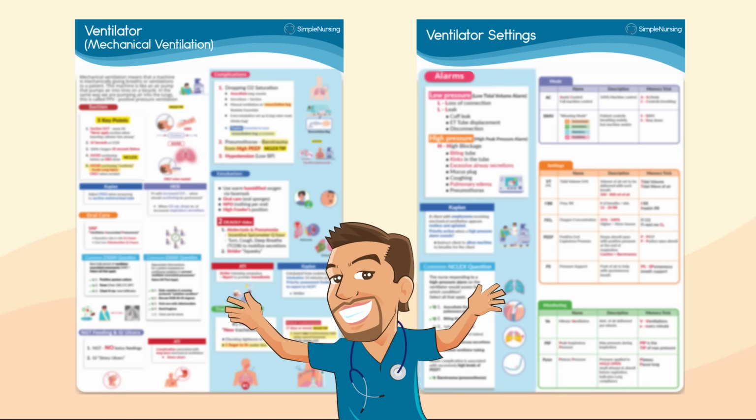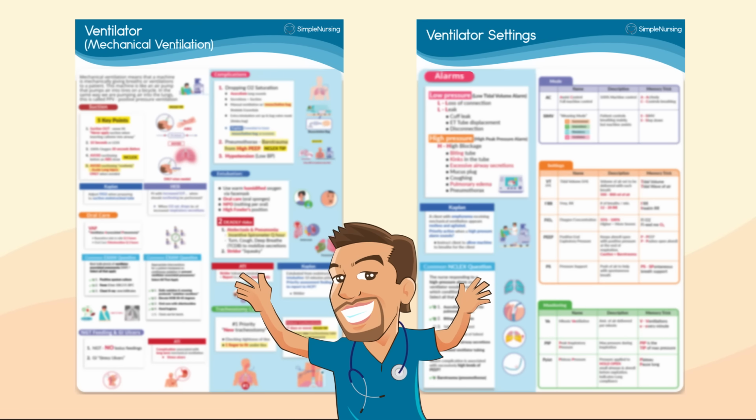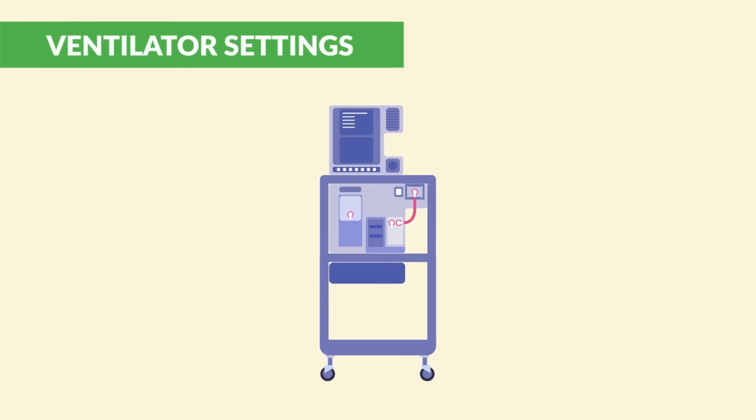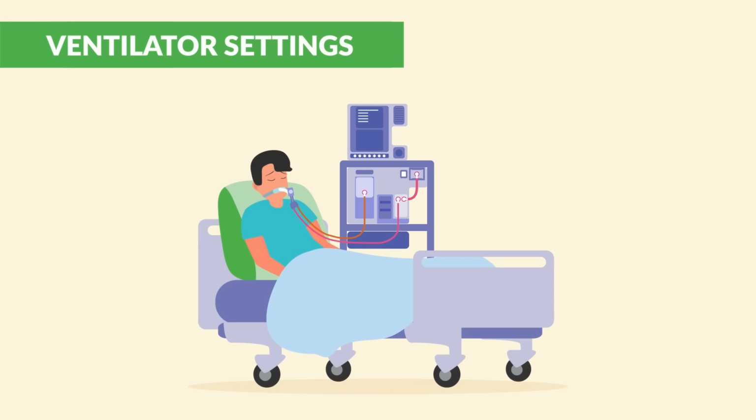All right, take a deep breath. See what I did there? And let's get started. Mechanical ventilation means that a machine is mechanically giving breaths or ventilations to a patient.